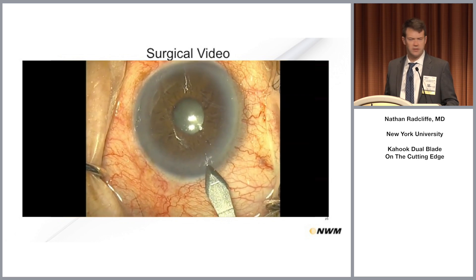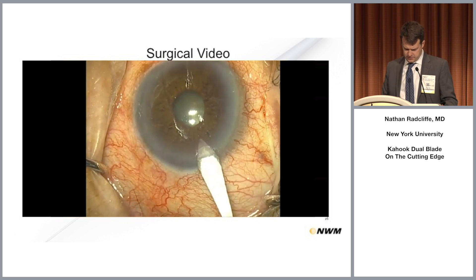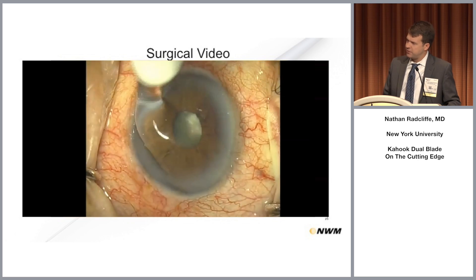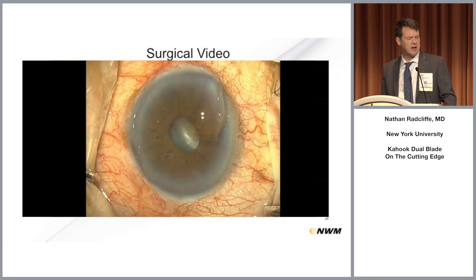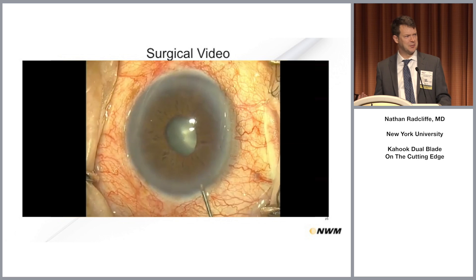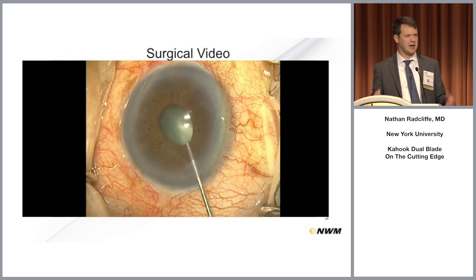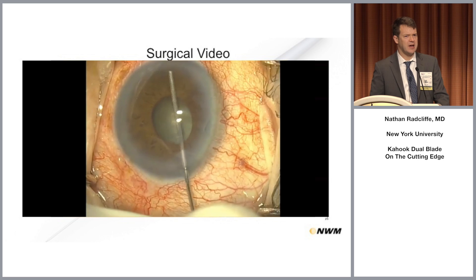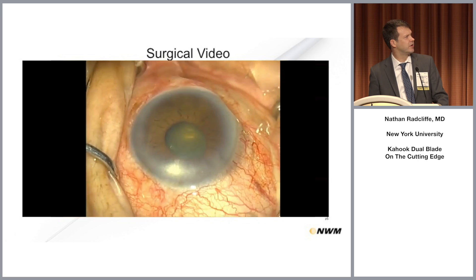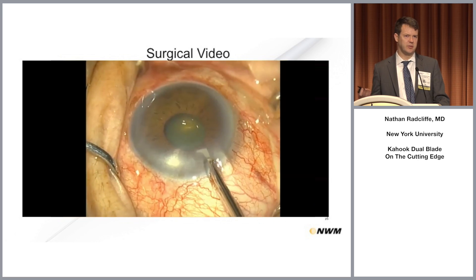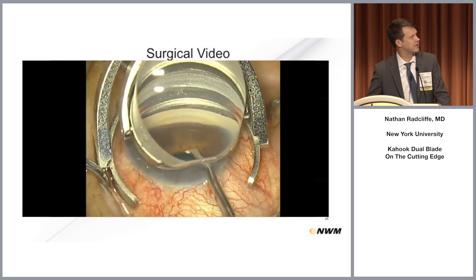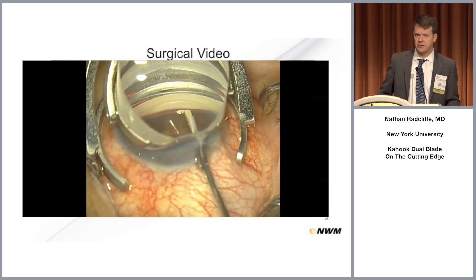Here's one more video of the entire procedure. Viscoelastic on the surface of the eye. Something that comes into mind when doing the surgery is viscoelastic management — you have your typical two vials for cataract surgery, but now we're inflating the chamber an extra time and putting viscoelastic on the cornea. I use any leftover dispersive viscoelastic on the cornea for visualization, and cohesive inside the eye. This is the Vold gonio lens, which has a Thornton ring on it for better control.